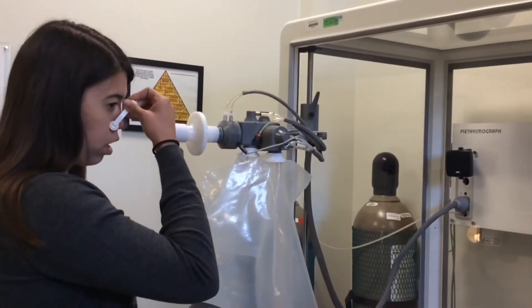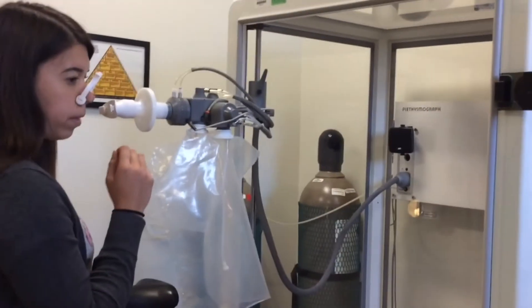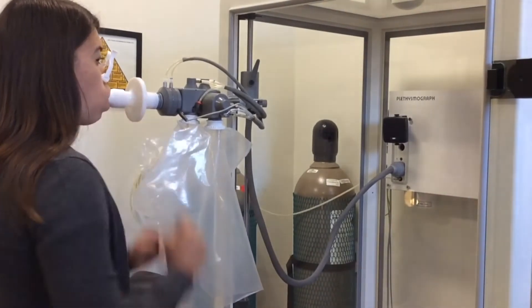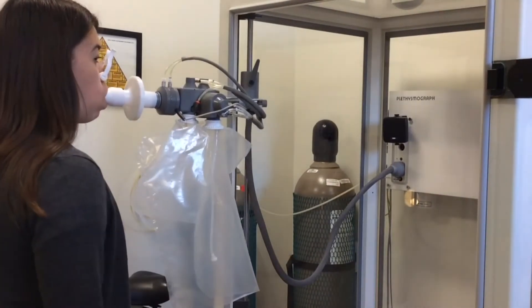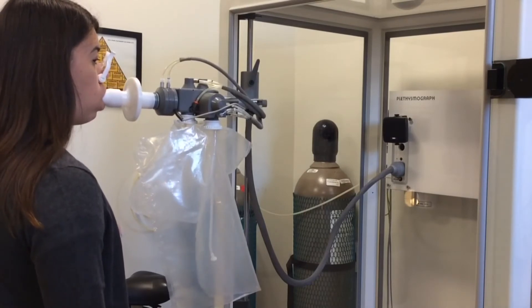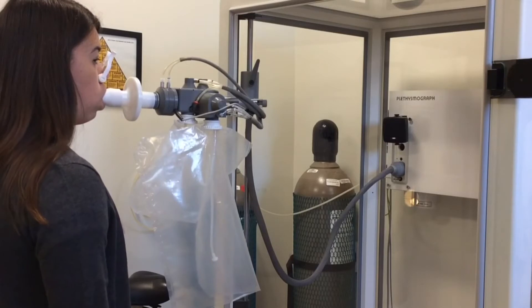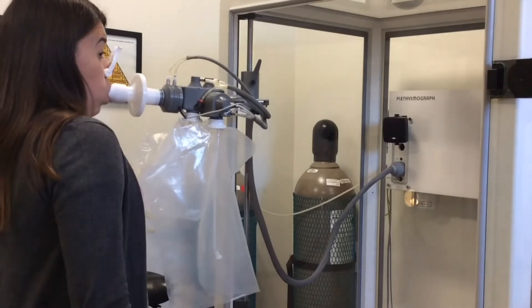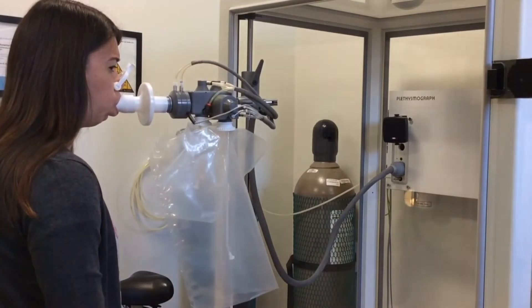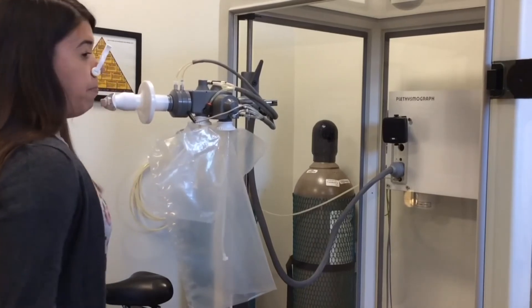We're just going to wait for that to zero out, Danielle. Now you can place your mouth on the mouthpiece. She's in a nice athletic stance. Just breathe easy — you can see the tidal breathing here. Big breath in, Danielle. Fill it up. Hit it high. Go, go, go, go, go. Keep going. Big breath in at the end. Excellent job.